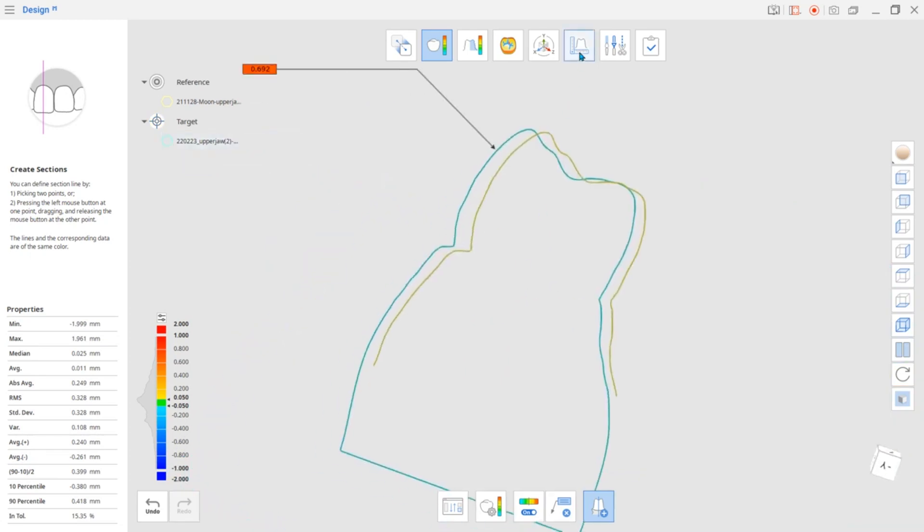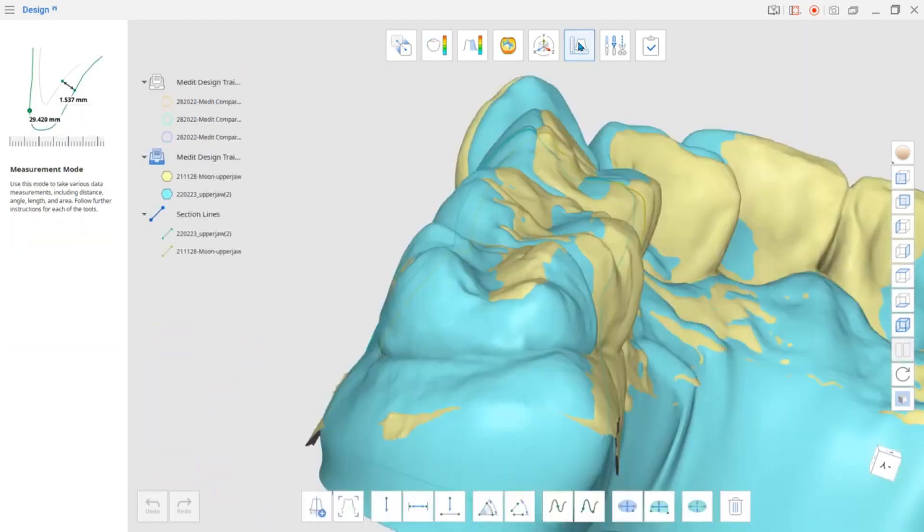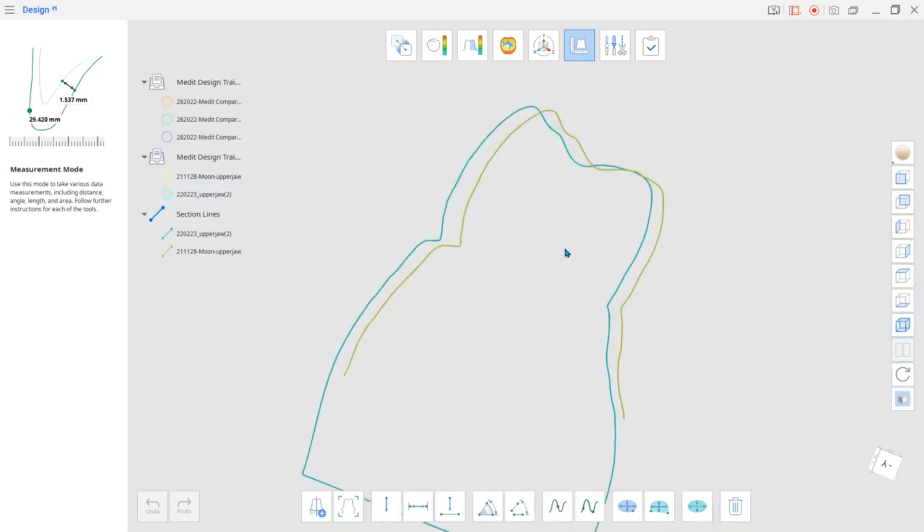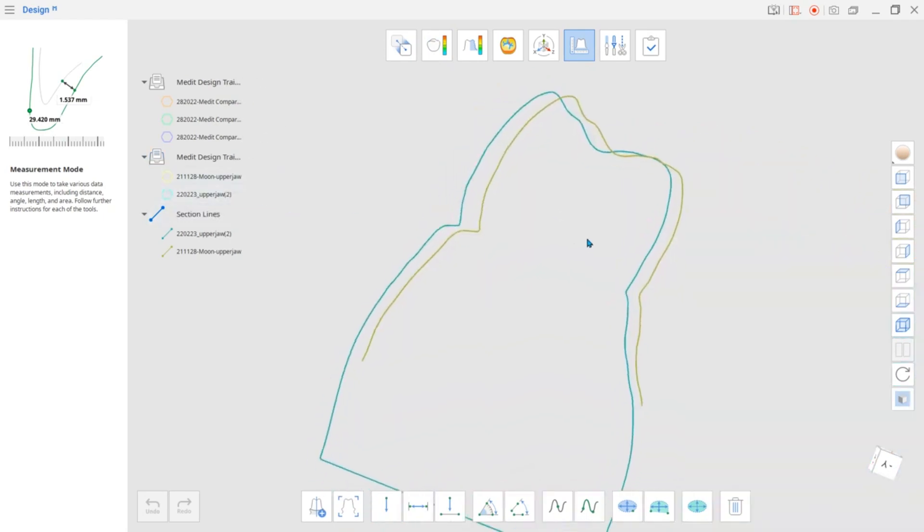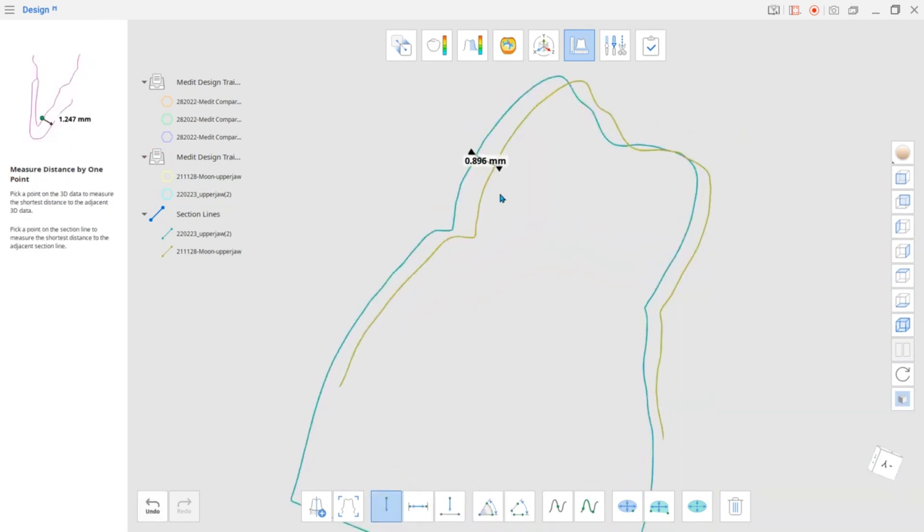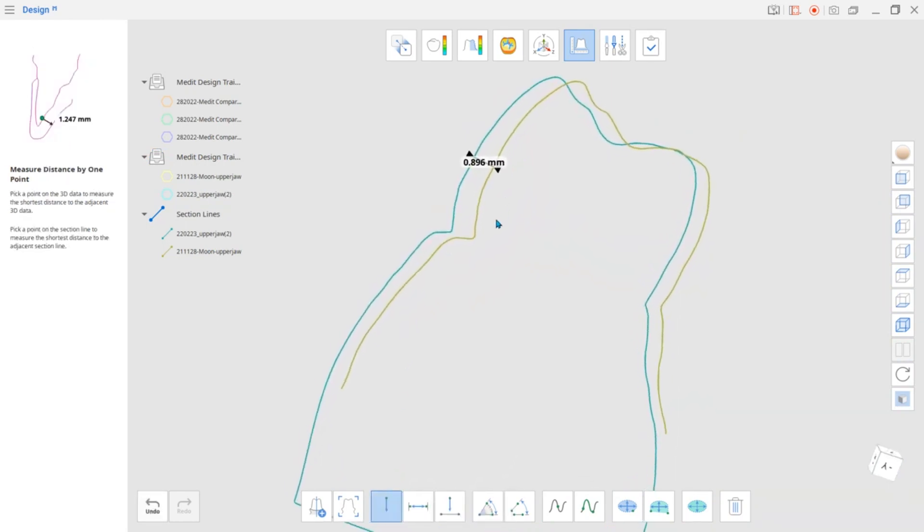To measure the section line, go to Measurement Mode. Use this mode to select points on the data and measure the distance between them.